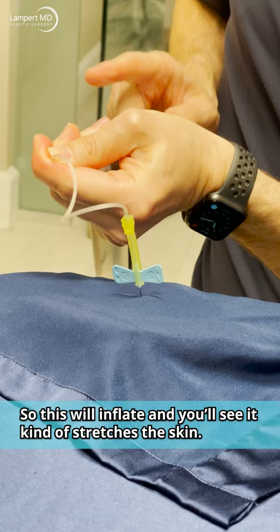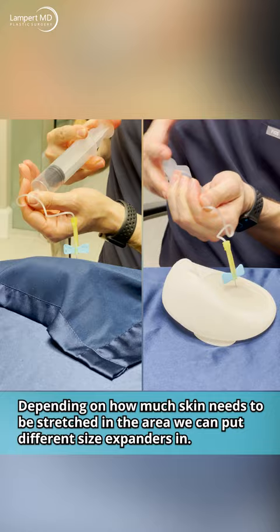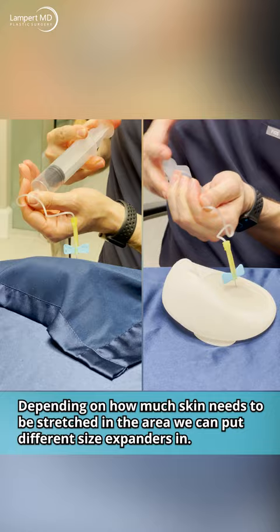We'll inflate it and you'll see it kind of stretches the skin. We'll do a side-by-side to show you the expander and what it looks like when it's not underneath the drape. Once we've fully expanded — and you can see how that stretches the skin quite a bit — we'll do another surgery to remove the expander, and then we'll use that extra skin to shape as we need.